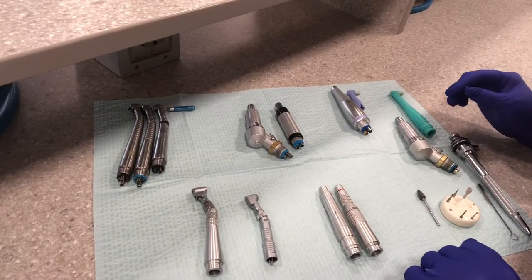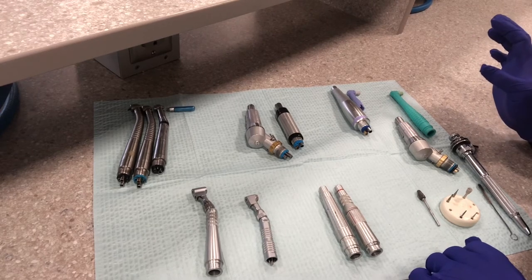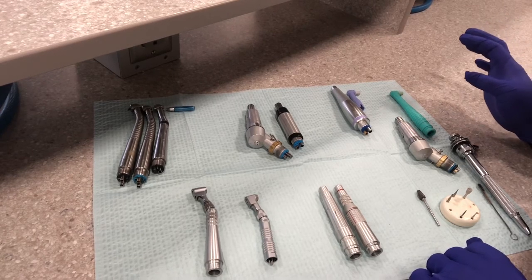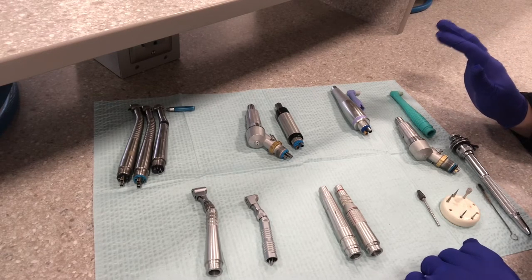I'm going to go through the handpieces — the slow speed and the high speed and the different attachments that we have for them. I know this looks like a lot when it's all laid out together, but it's just because there are different versions and options for a few of the different things.